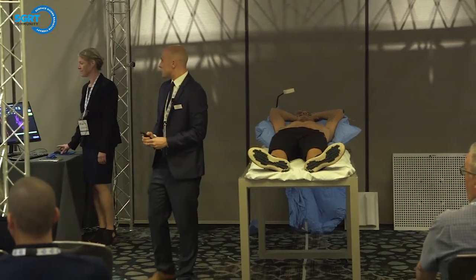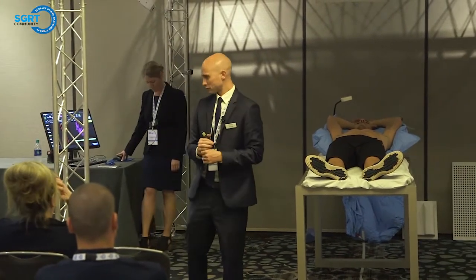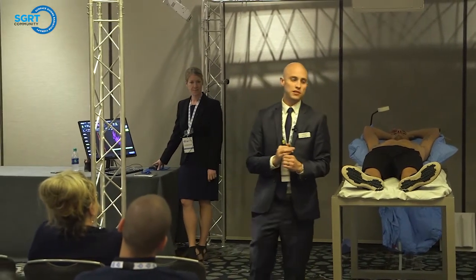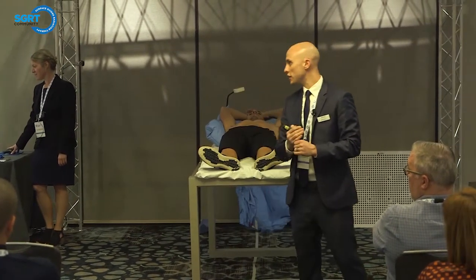All right, so now that we know the basics of DIBH, let's begin with what it's going to look like in treatment mode. In our simulation with deep inspiration breath hold, we have 2 CT scans. We'll do a breath hold scan and then a free breathing scan. Both of those generate a structure set for us to use. This is extremely beneficial for us as therapists to set up our patient, because we can start with our free breathing structure set, get them in the general position, and switch over to the breath hold. It's not as hard to get them in the position, because they're generally where they need to be.